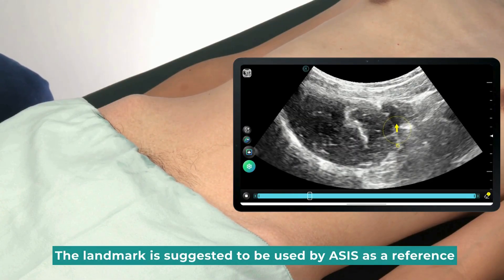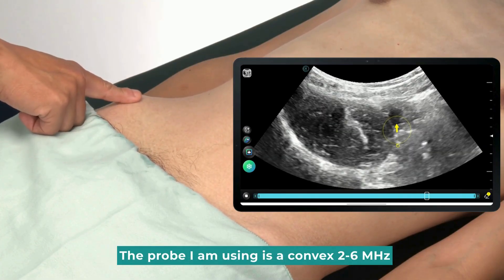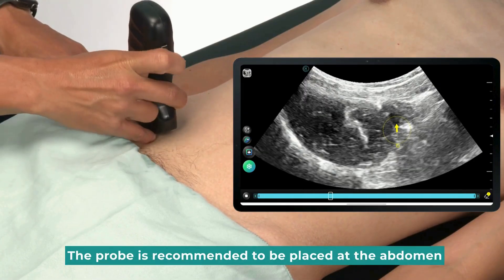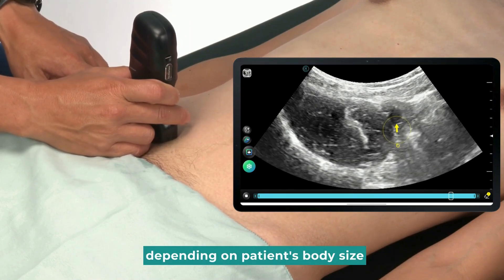The landmark is suggested to be used with the ASIS as a reference. The probe can be placed here. The probe I am using is a convex 2 to 6 MHz. The probe is recommended to be placed at the abdomen. The depth of the probe can be adjusted from 5 to 10 cm, depending on the patient's body size.